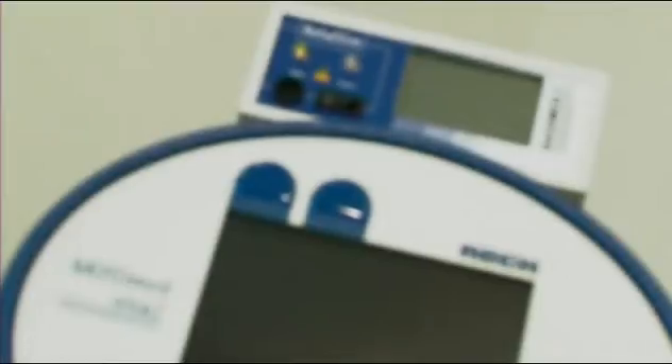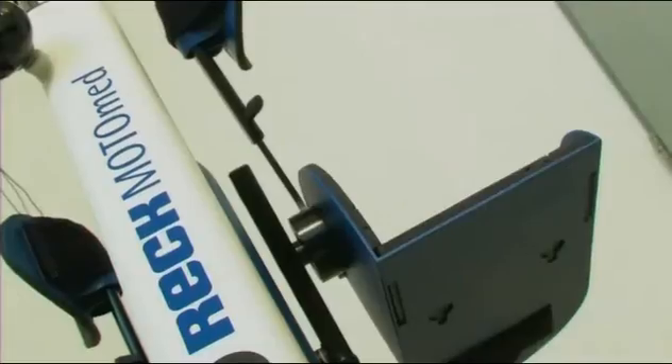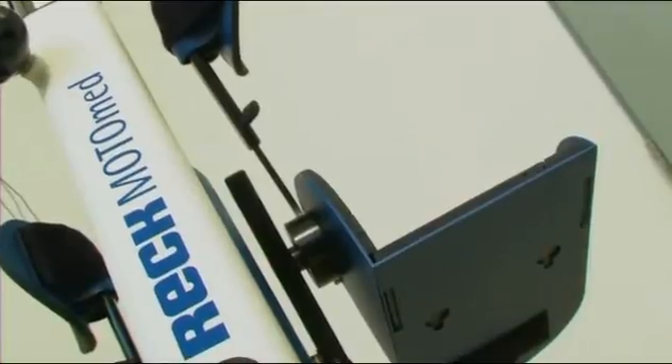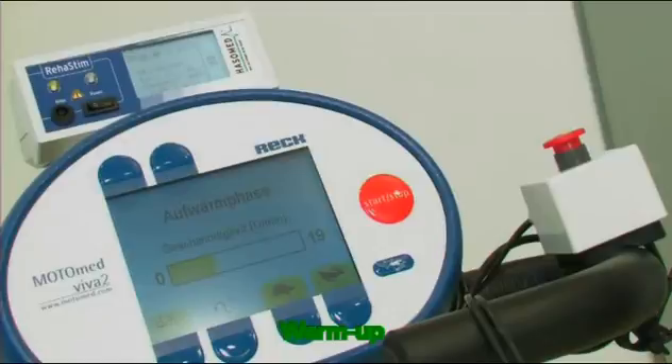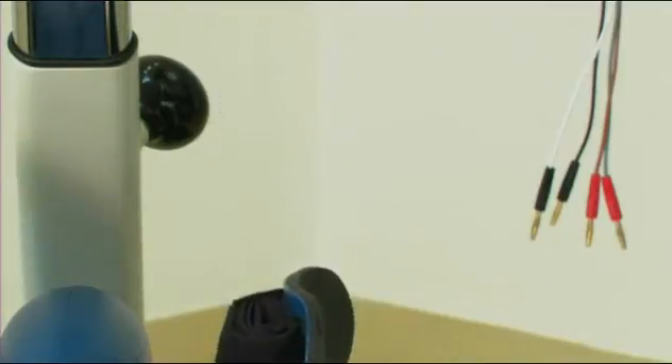RehaMove combines conventional motion training with functional electrical stimulation. Functional electrical stimulation assists people with movement disorders of their legs or arms due to disease or accident. With the extension of a MotoMed Viva 2 with the RehaMove control, therapy options can be transformed from passive into active motion training.